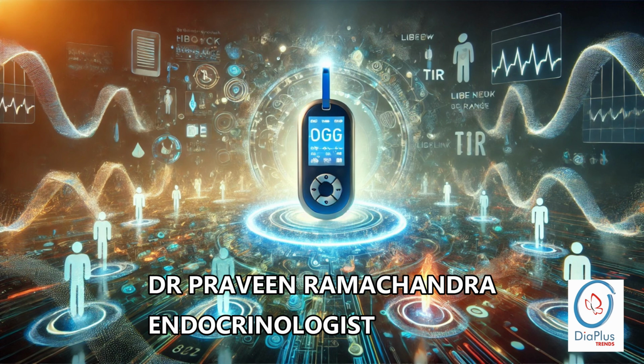Exactly, that's the goal. And this shift is driving the development of all these new tools like connected CGMs. These devices go beyond just measuring your glucose. They give you a constant stream of data showing those all-important fluctuations, and they generate really detailed reports to help us make sense of it all. So it's like having a GPS for our glucose. Yeah, that's a great way to put it. And these connected CGMs generate something called an ambulatory glucose profile, or an AGP report. Basically, imagine a visual map of your glucose levels over time so you can see those peaks, dips, and trends. This personalized roadmap allows you and your healthcare provider to fine-tune your diabetes management in a much more precise way. I see how these patterns can help us make more targeted adjustments.